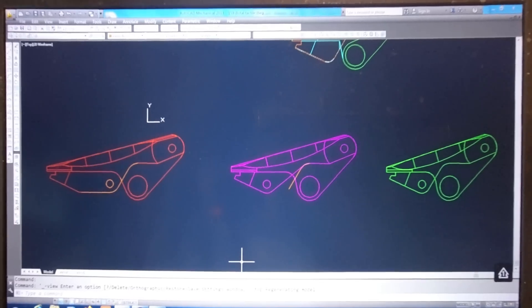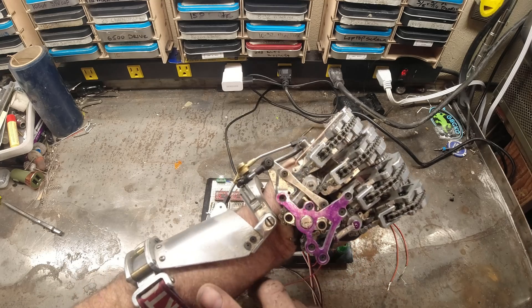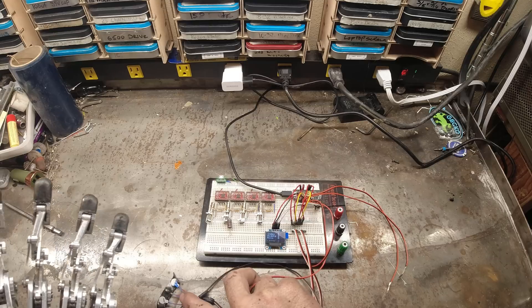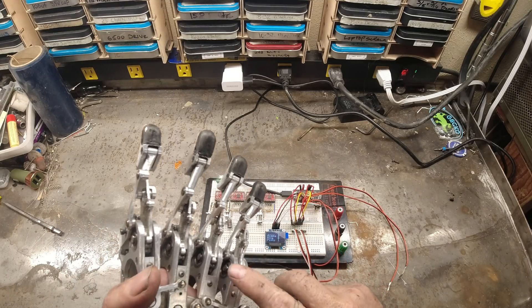The FSRs are embedded in new distals. The Metro Mini, display, and battery packs would be mounted in the forearm assembly, and the haptic motors would be mounted somewhere in my socket contacting my residual limb.